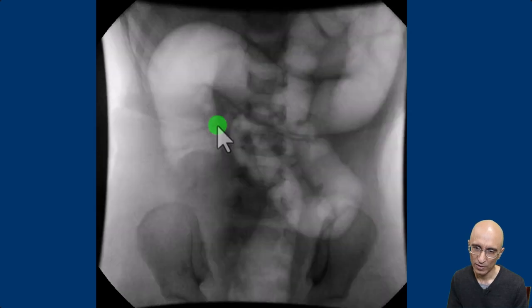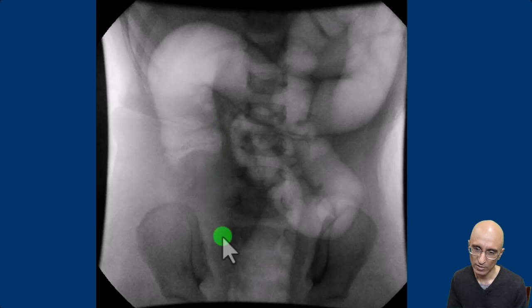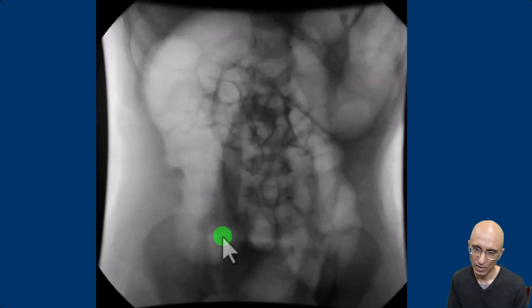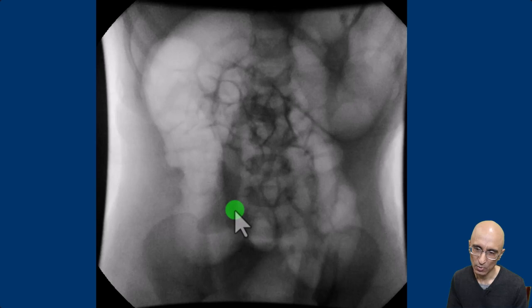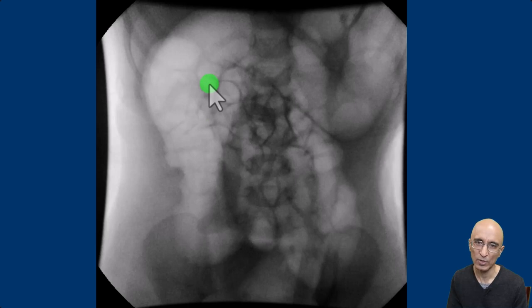On further instillation of air, the intussusception was pushed to the right lower quadrant. On this image you can see air entering into the small bowel loops and a slightly thickened region of the ileocecal valve. This represents a successful pneumatic reduction of the intussusception.